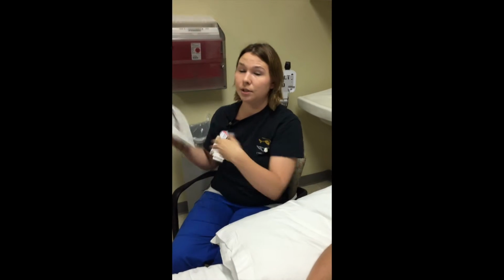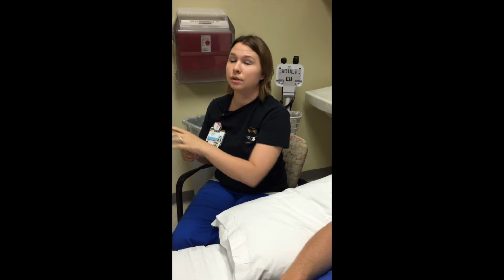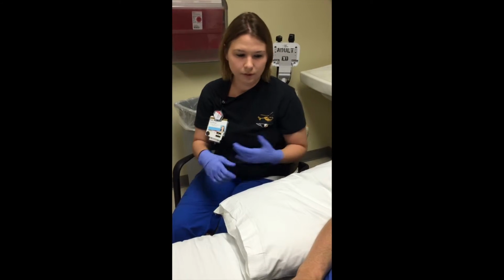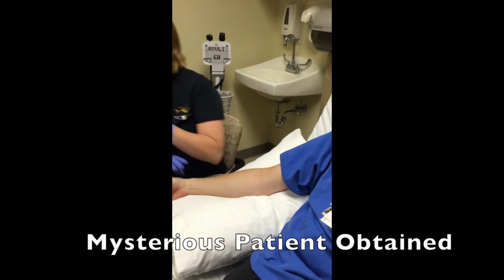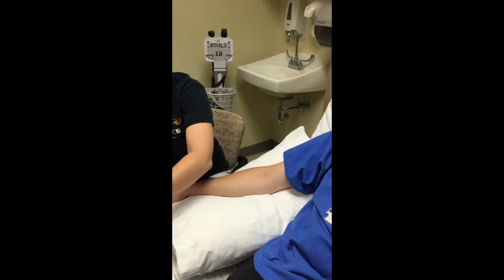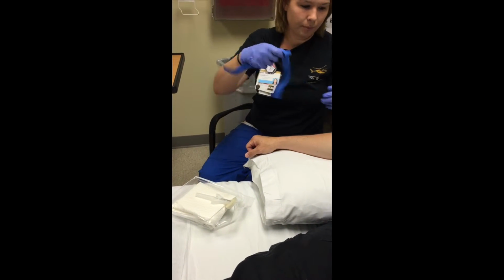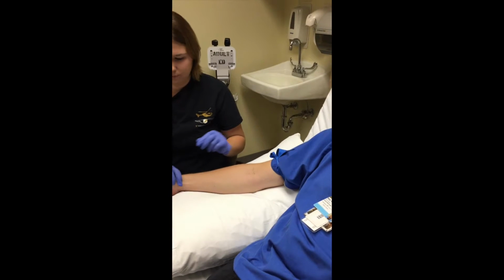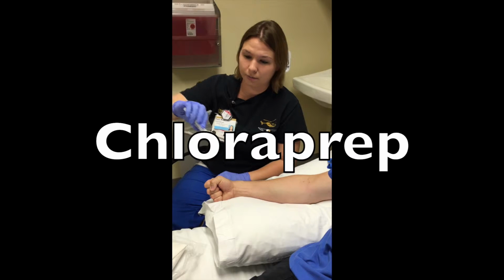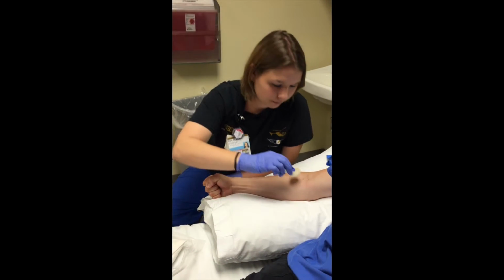So you're going to come into your patient's room. You will have already foamed your hands at that time. You are going to obtain and put on a set of regular gloves. You're gonna obtain your patient. You're going to open your kit. Gonna put on the tourniquet, make a fist for me a couple times. You're then going to prep the vein with the prep. You wanna make sure that you're going from the inside out.